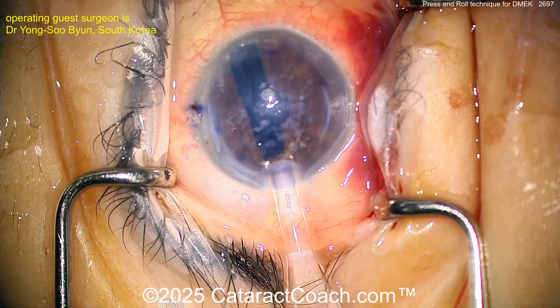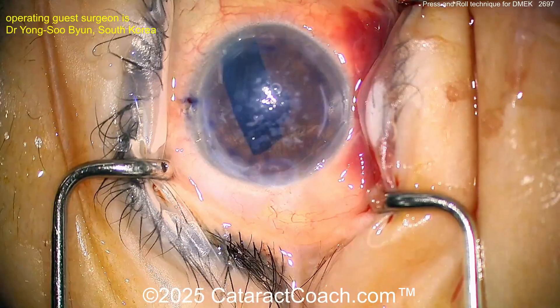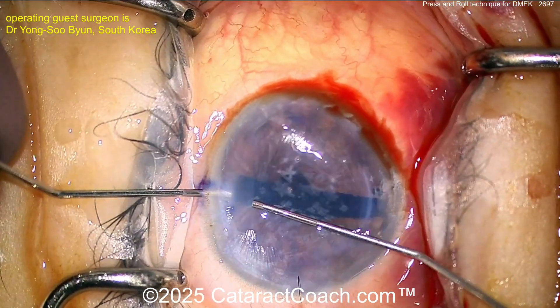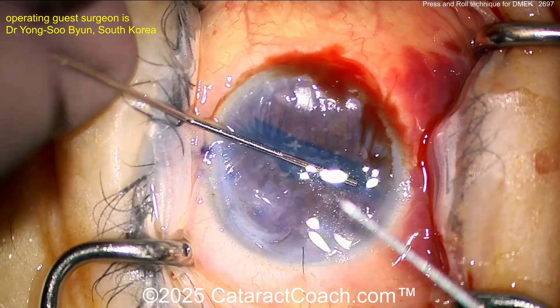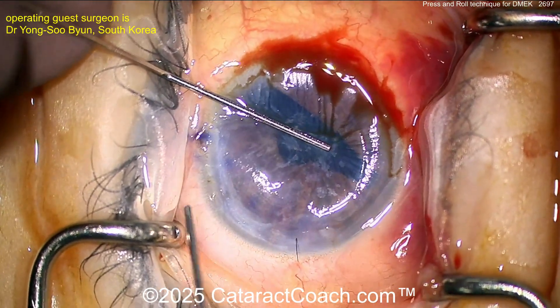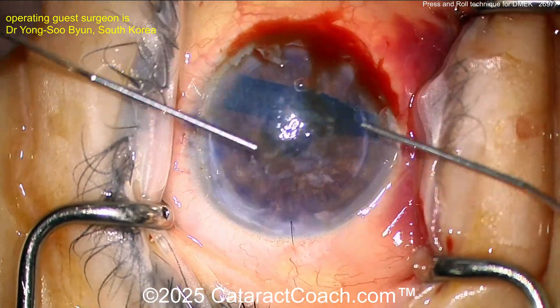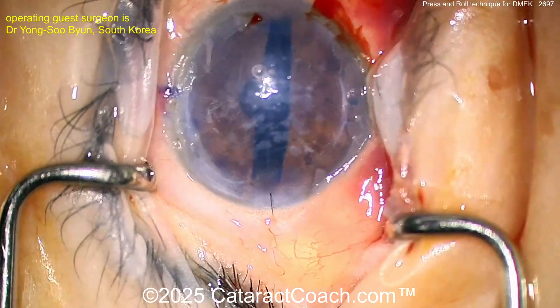Very importantly, don't let the graft come out of the main incision — flatten out the eye and hold down that incision. It's a good idea to suture the incision. Confirm the graft is in the correct orientation; it's rolled up and stained with trypan blue dye. The graft's positioning is confirmed, then the surgeon presses the center of the cornea down, flattening the AC — more tricky in post-vitrectomized eyes.